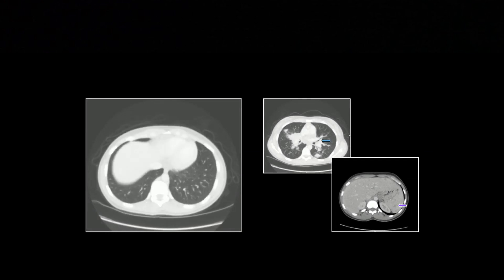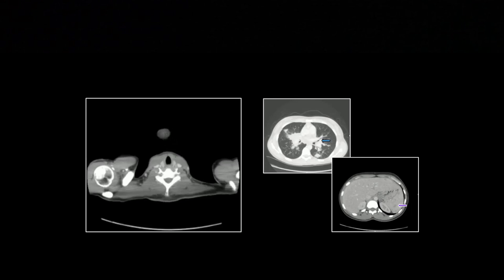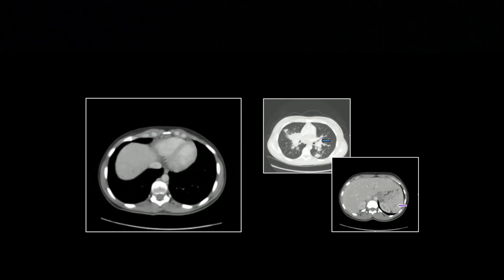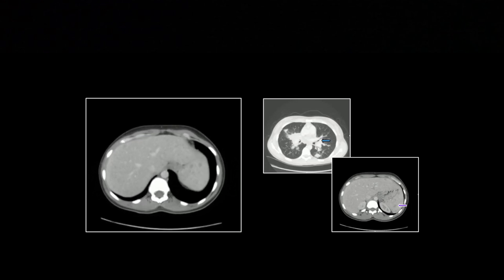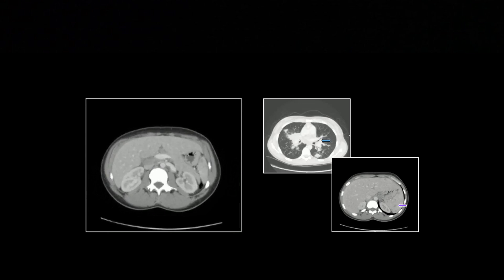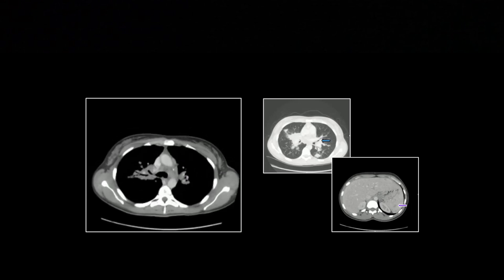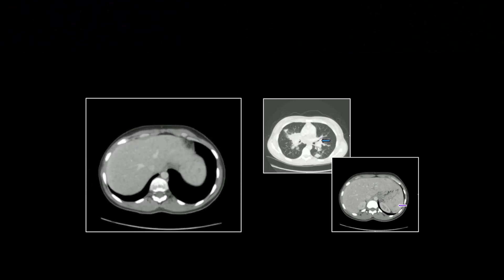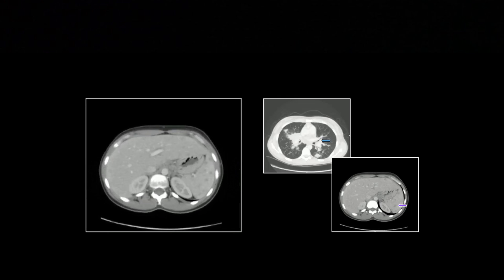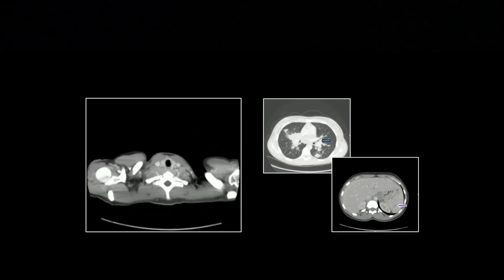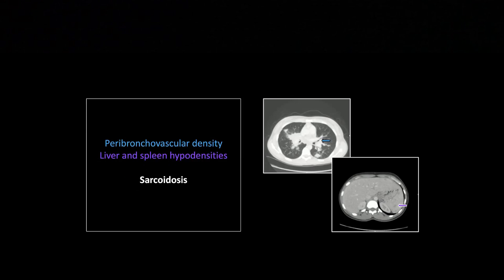That is another case of sarcoidosis. There are the soft tissue windows, just to let you appreciate the liver and spleen findings. They're pretty subtle, but if you're really focused on it, you can see they're quite numerous. So that's sarcoid with peribronchovascular density.